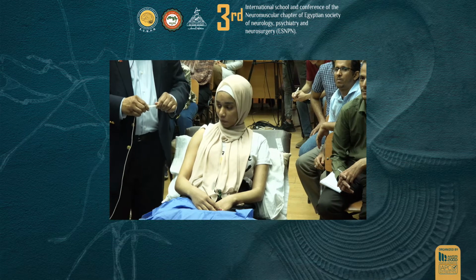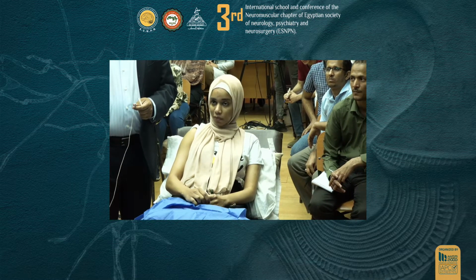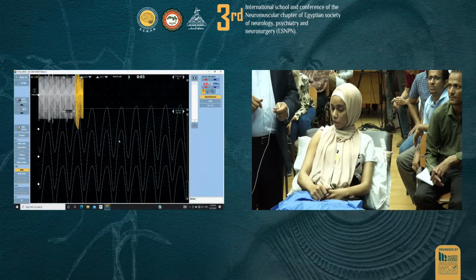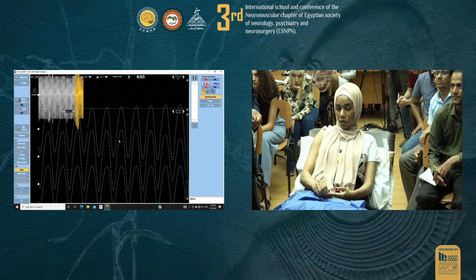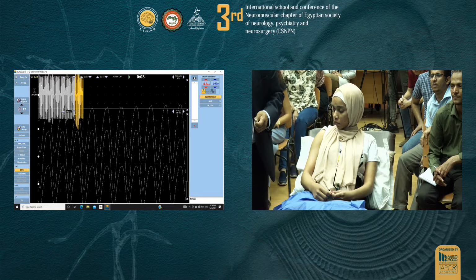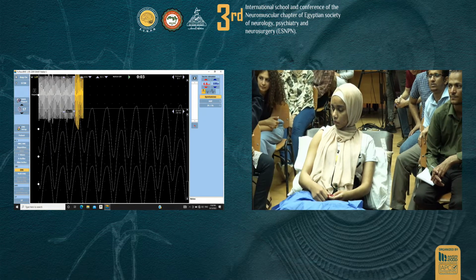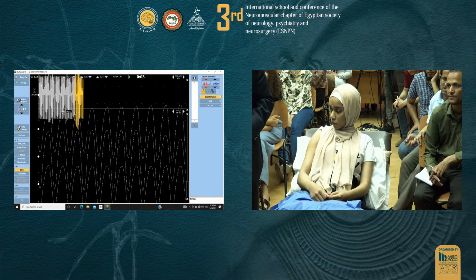Okay, good. But they can't see the screen. They can see the patient, but I want them to see the screen. Oh, that's good. Now good. Okay. So, sorry, first ground, please. And the gel, please, and some tape, please. Thank you. That's too much.